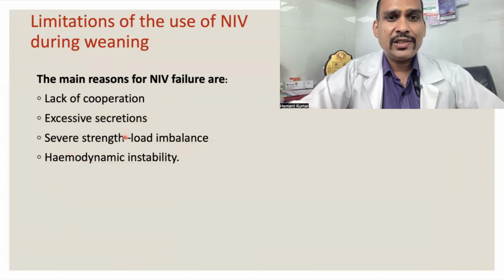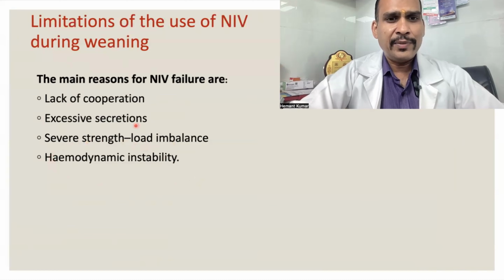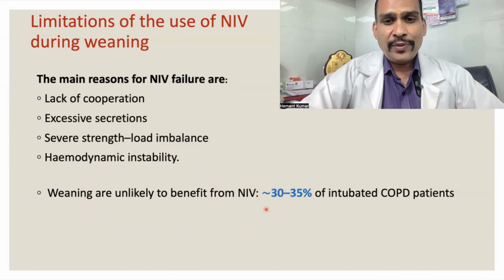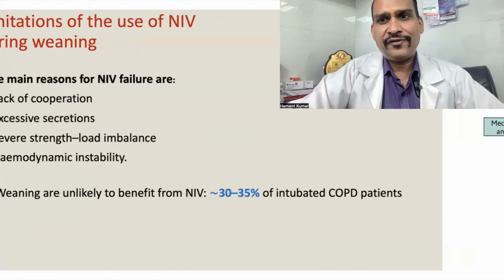Severe strength-load imbalance, meaning the muscles are very weak. Severe critical illness, neuropathy, myopathy may end up in weaning failure, and hemodynamic instability. These are the causes which can cause NIV failure even after extubation. So weaning patients are unlikely to benefit from NIV in around one third of cases. So in one third of patients, even if you apply NIV, they will fail.